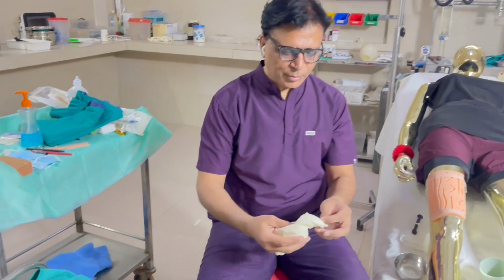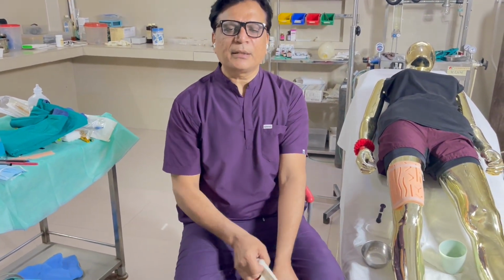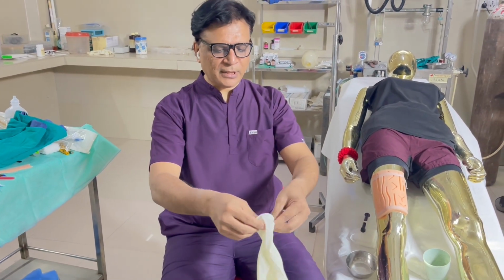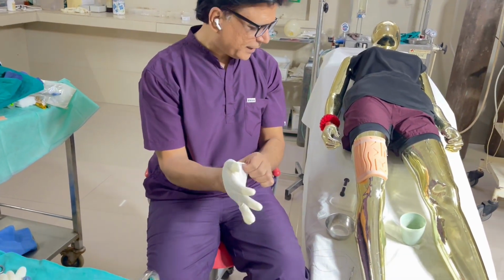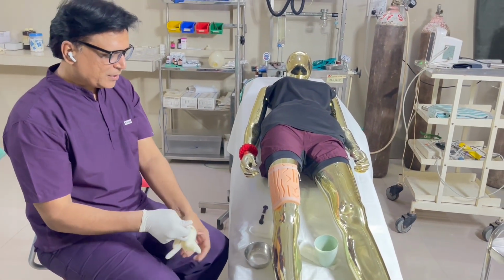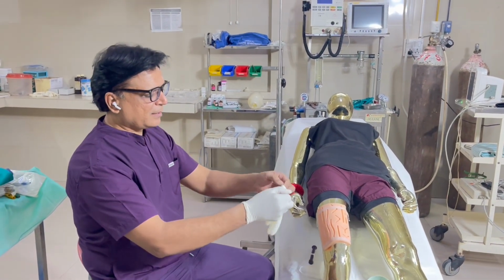For that, if the gloves are already there outside, you can do it, but if you have to put the gloves on inside, just make a habit of putting the gloves on as fast as possible. So this involves putting on the right and left hand gloves. So this is the skill procedure station. Here you don't need to do anesthesia or anything, everything is already there.